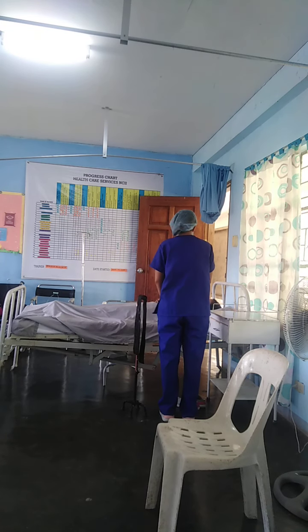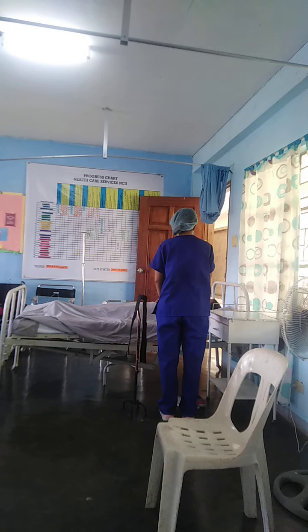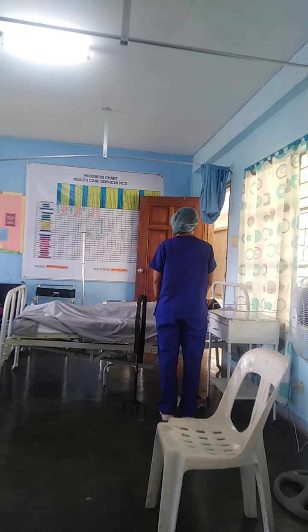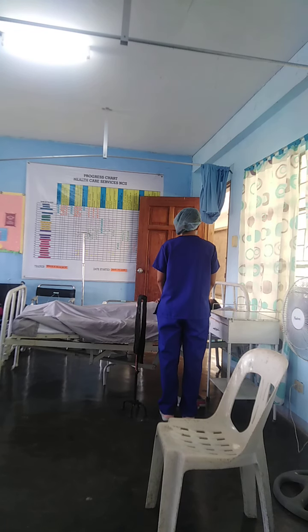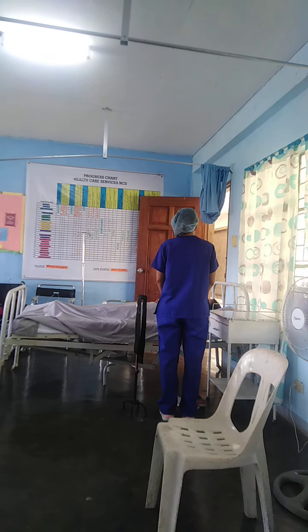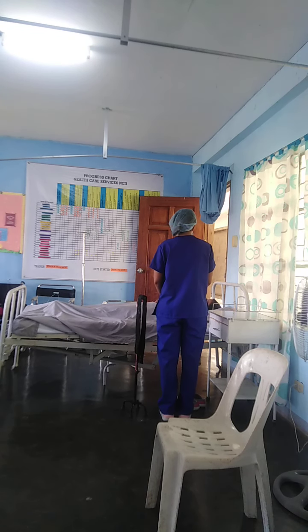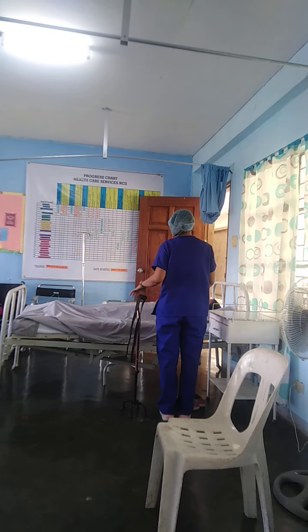Good morning, ma'am. I'm your healthcare staff for today — I'm Honeybelle Rabanal. I'm going to talk to you, ma'am, to assist you in walking.